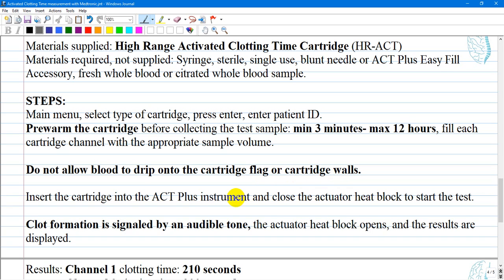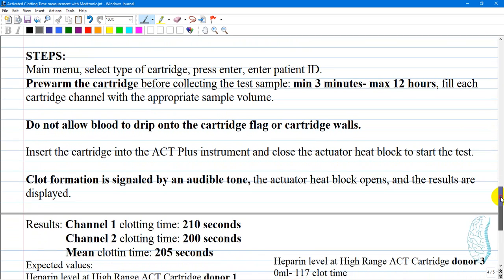Insert the cartridge into the ACT Plus instrument and close the actuator head block to start the test. Clot formation is signaled by an audible tone. The actuator head block opens and the results are displayed in seconds.